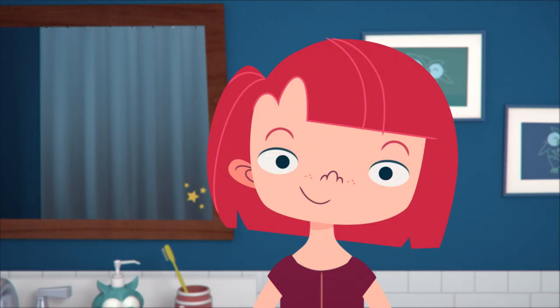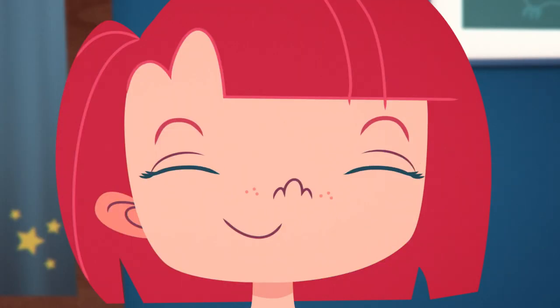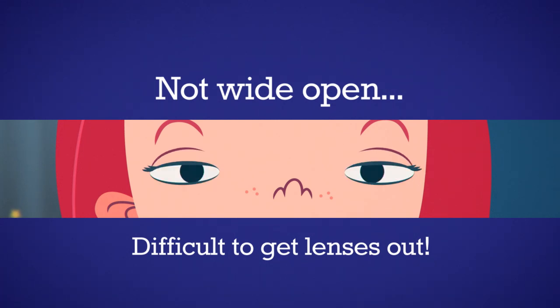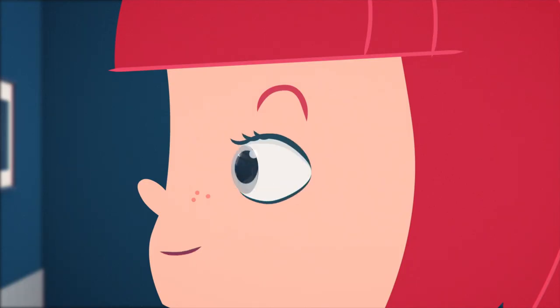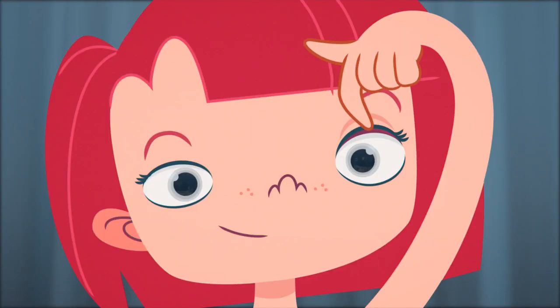Here's the most important part: holding your eyelids open. You're trying to create as much space as possible to remove the lens, so it's important to keep both eyes open and fight the natural urge to close them. With the hand that you won't be using to take your lens out, use your pointer finger to gently lift the eyelashes of your upper lid towards your eyebrow, pressing the lid against the bone.